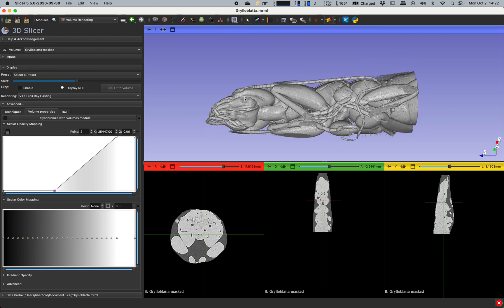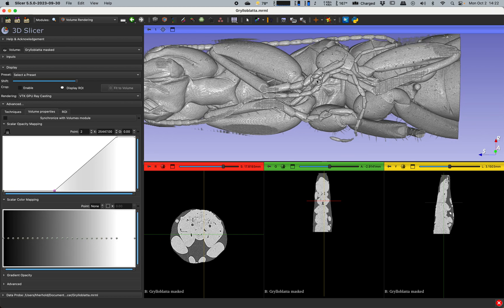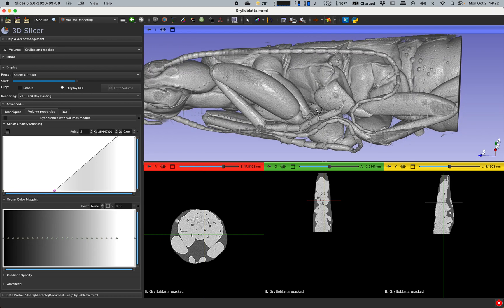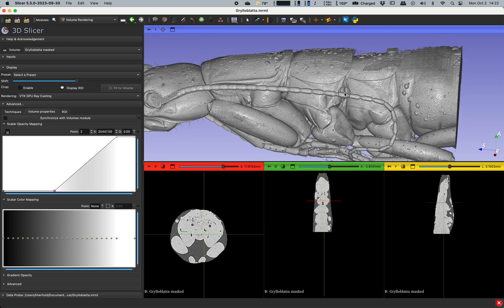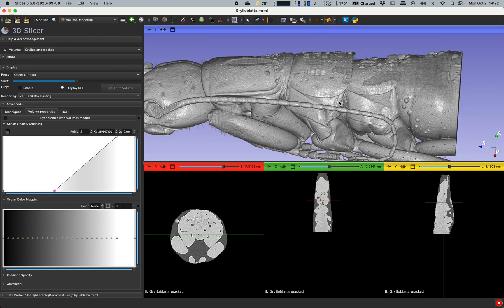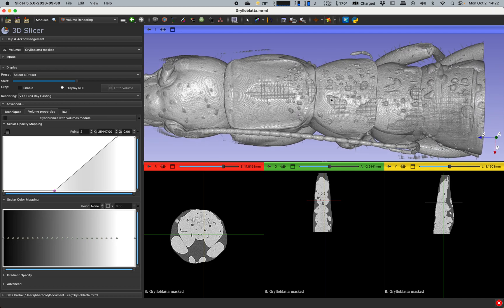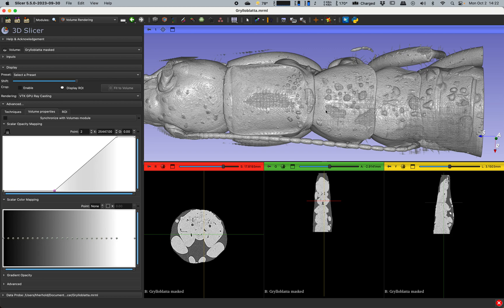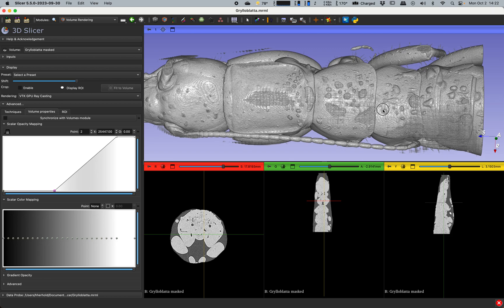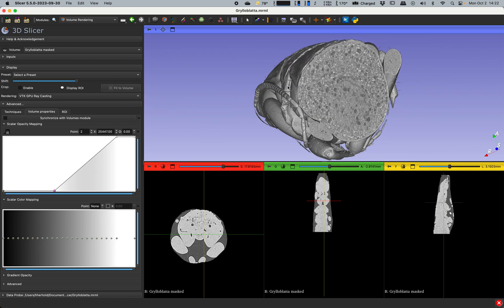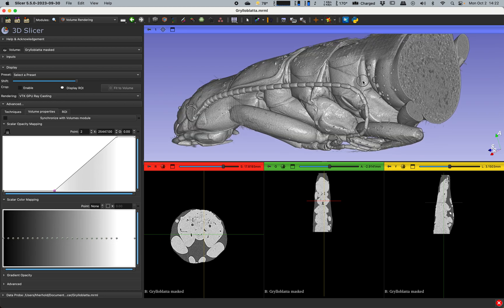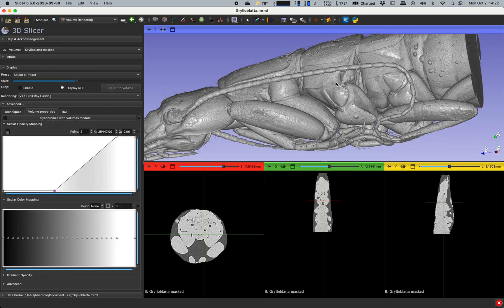Because the vial actually has a very similar density to the cuticle of the insect. When we're trying to paint the insect later on and differentiate it from the air on the inside, it's kind of cumbersome to deal with the vial. So this operation here of vial removal also makes it easy to look at the outside of the insect which is very useful for finding spiracles when we start doing our segmentation for looking at tracheal airways and stuff. So it's a little bit of a preprocessing operation here and then we get a nice clean volume that is just the insect.